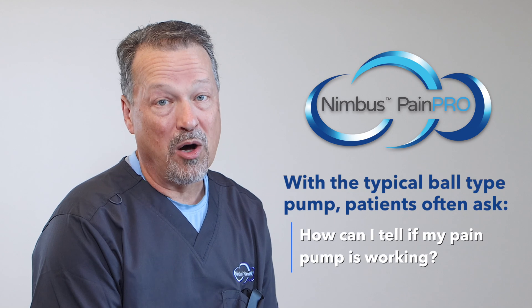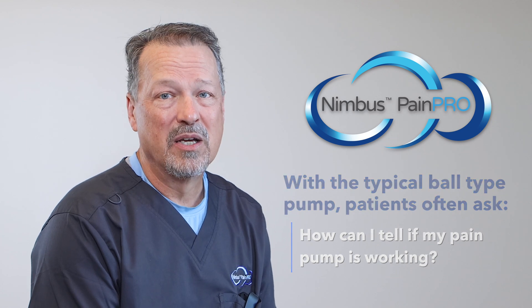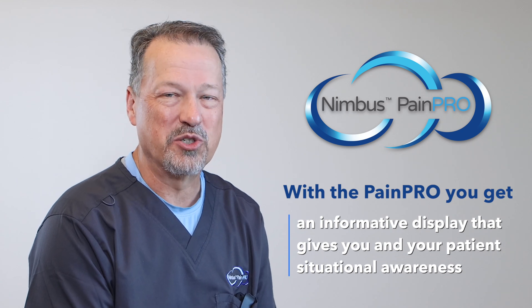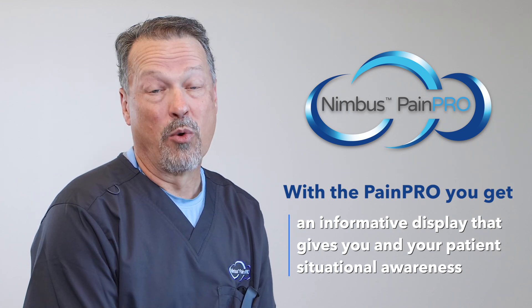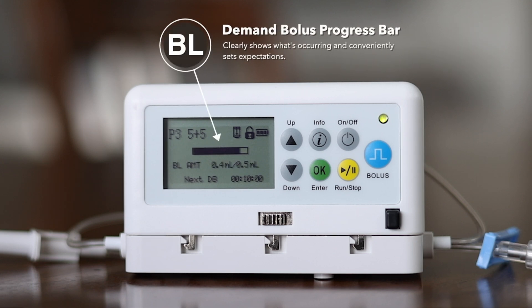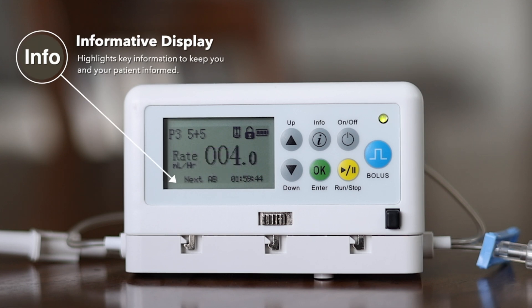Most of us know that patients are often overwhelmed with post-op recovery and pain management instructions. With the typical ball-type elastomeric pain pump, patients often ask: how can I tell if my pump is working? With the Nimbus PainPro, you get an informative display screen that gives the patient and the clinician situational awareness. See the green light on the front? See the progress bar as your demand bolus is being delivered? See the bottom of the display where every few seconds the patient is informed about how much anesthetic volume has been infused or how much time until the next demand bolus is available.